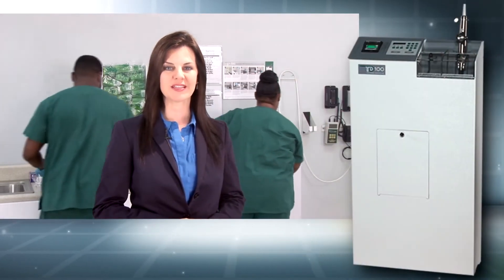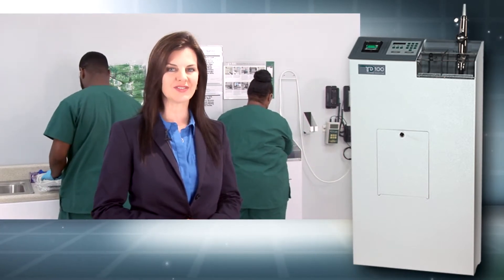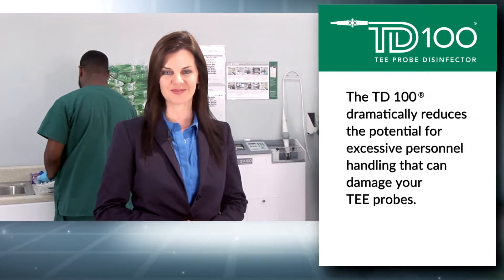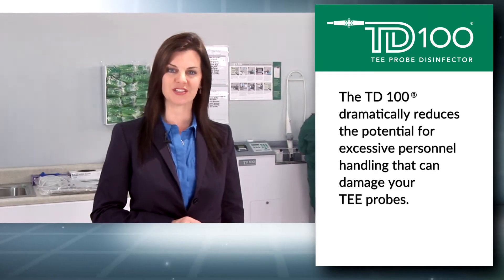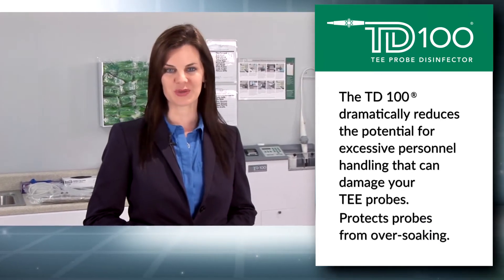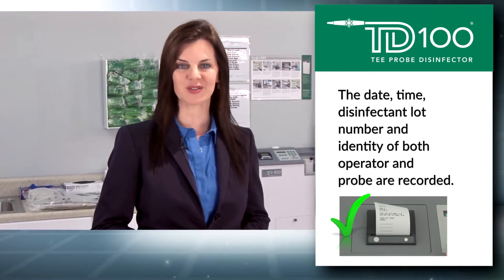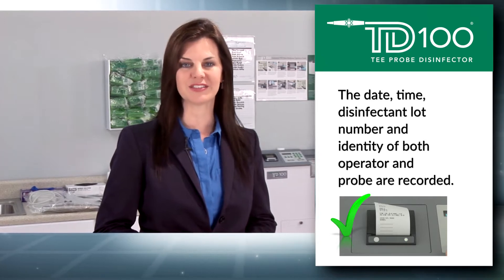The TD100 automated disinfector is FDA cleared to provide high-level disinfection of TEE ultrasound probes while reducing operator exposure to the disinfectant. The TD100 also helps minimize probe damage due to excessive personnel handling and eliminates the potential for over-soaking. A printed verification record is generated at the conclusion of each disinfection cycle to confirm the TEE probe has been successfully high-level disinfected.